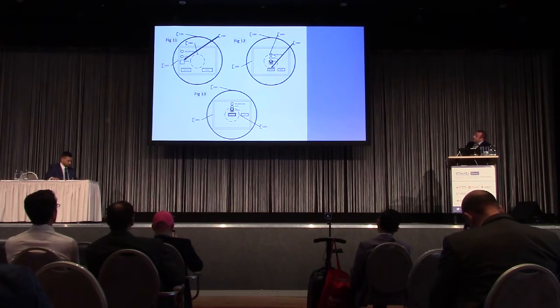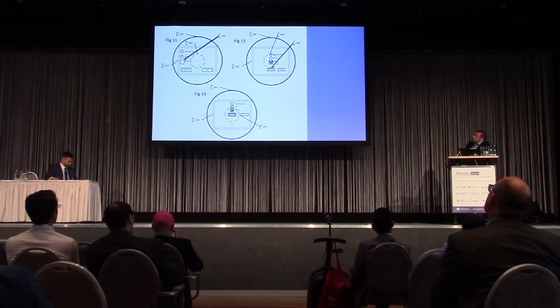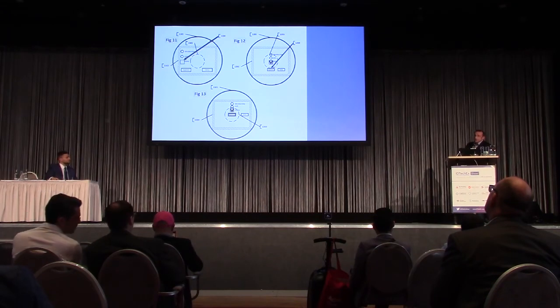And then 1204 shows us the next point of interest of the user, which is the approve button. So the user wants to approve his selection. He did a checkbox, whatever that might mean for the system, for this particular application. And the next thing he wants to do is approve. Right, so there is an attempted accommodation, again, to the approve button. Apparently the user, without changing his focus, will bring down his eyes in an attempt to accommodate to that button. The system is going to recompute the disposition and display of all UI components, the entire image, and the approve button is going to come in focus in figure 12 at the center of the display.